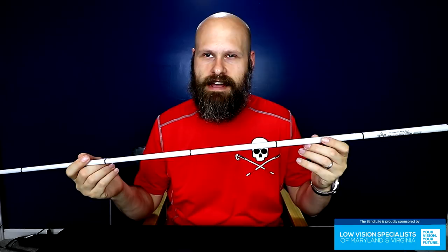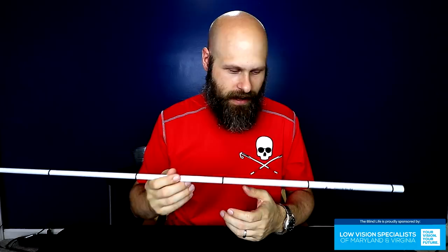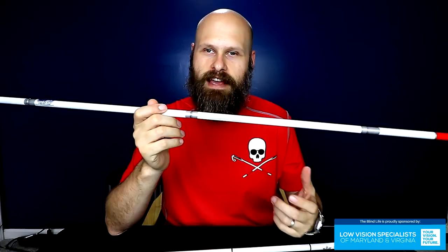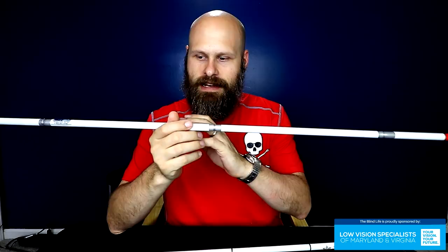People have asked me if I would ever get a different colored cane, and in my opinion I would not. Part of the purpose of the cane is to be identifiable for what it is — because of the white with the red, or just the white. If you change the color to cheetah print, tiger stripes, or camouflage, you lose part of the effectiveness of the cane because people might confuse it for something else. So I would stick with the white or the white and red.